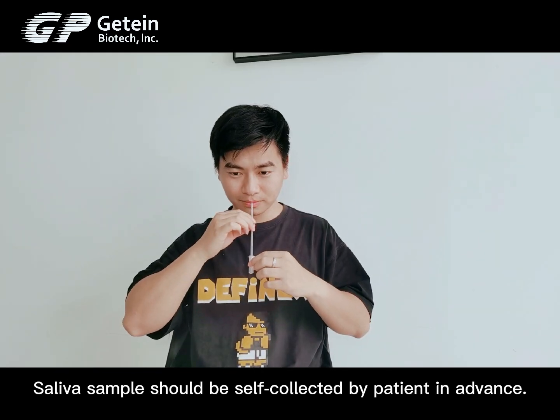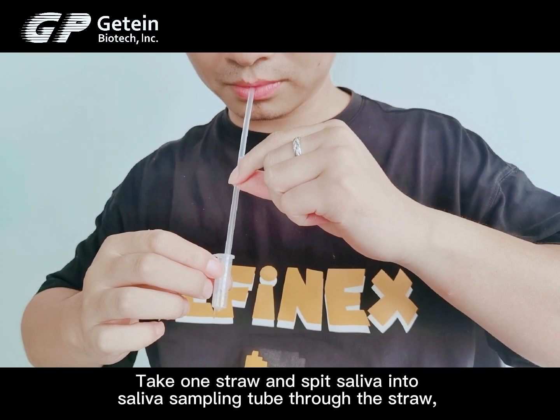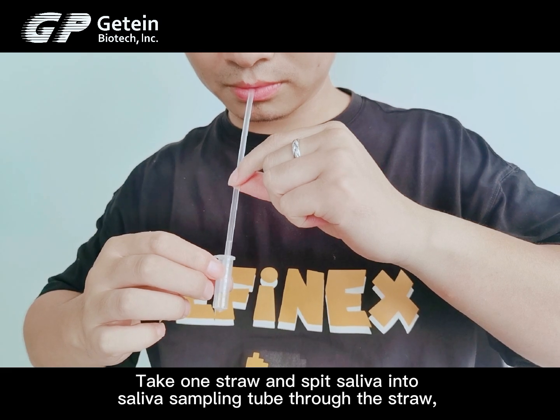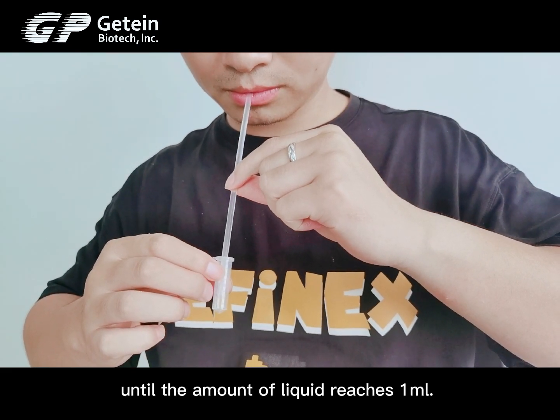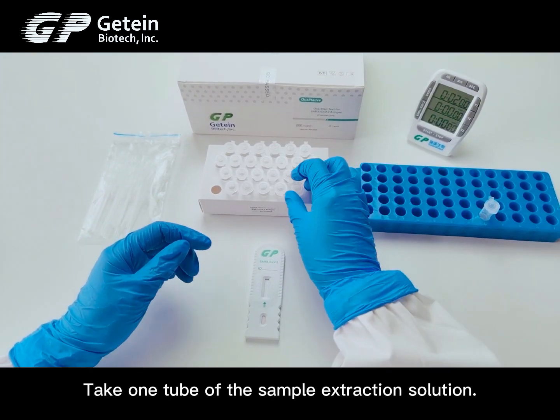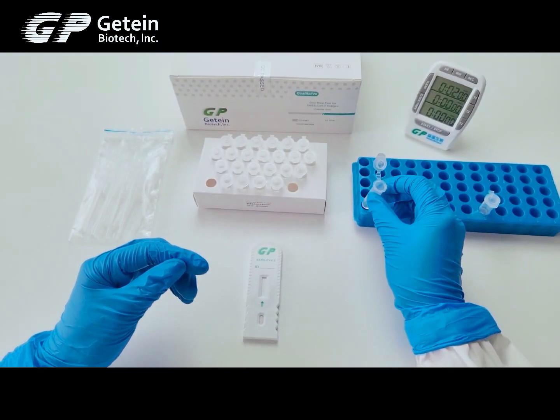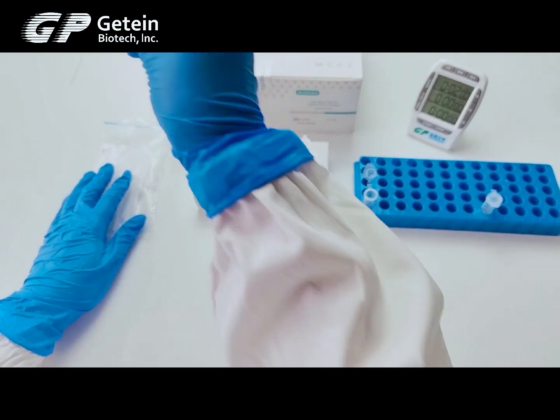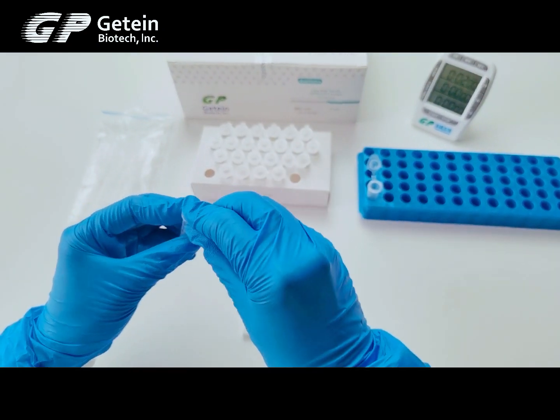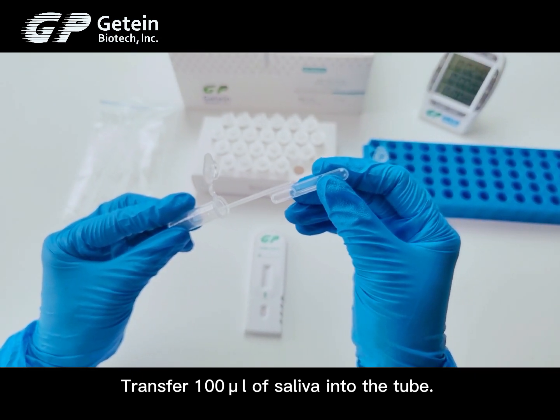The saliva sample should be self-collected by the patient in advance. Take one straw and spit saliva into the saliva sampling tube through the straw until the amount of liquid reaches 1 ml. Take one tube of the sample extraction solution and transfer 100 µL of saliva into the tube.